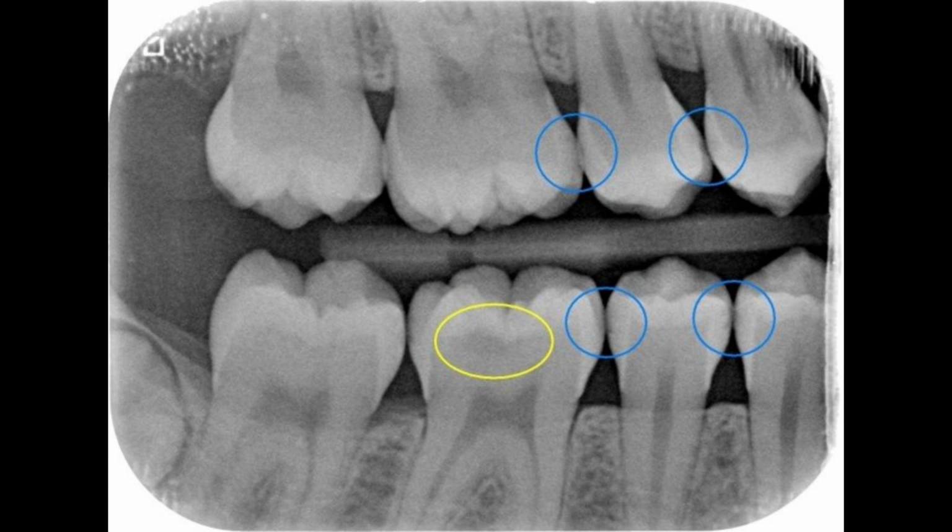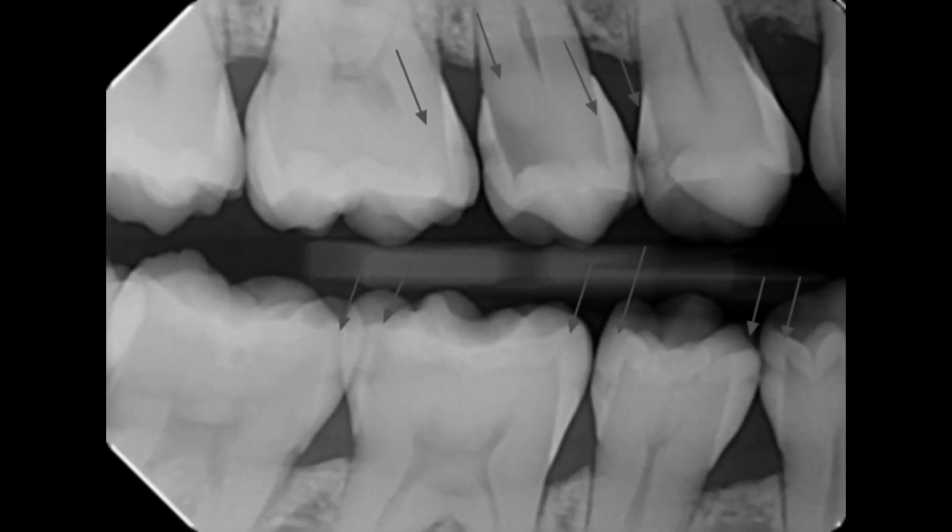Because of dental x-rays, a treatment plan option to repair the tooth can be given to the patient before they have discomfort. If you look at the decay in the images with the arrows, the decay here is quite large. These may be giving the patient pain. Either way, cavities are detected easily on an x-ray.